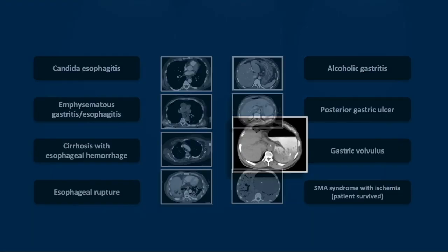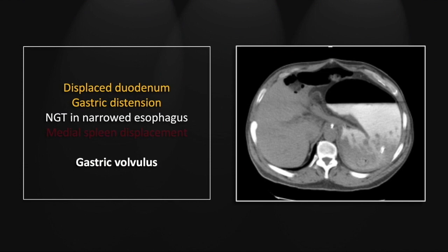Our next case is a gastric volvulus. This is a tough one, but that is the duodenum — the first and second portions of the duodenum dragged out of place by the displaced gastric antrum, which is flipped upwards and posterior to its normal position. Note the marked distention of the stomach, suggesting there is a serious element of outflow obstruction.